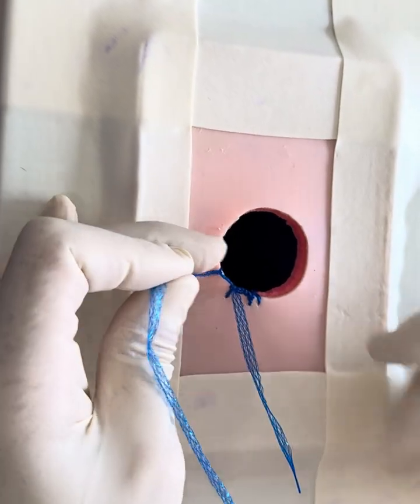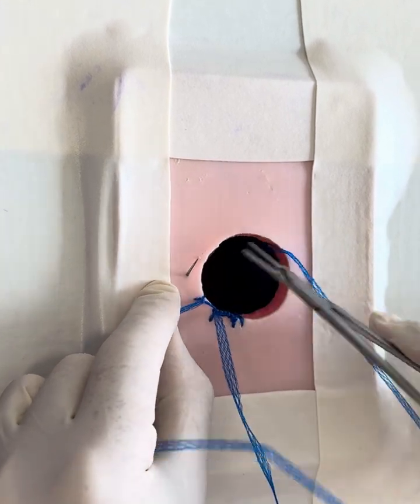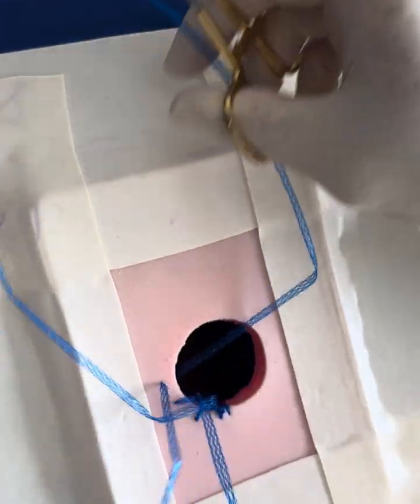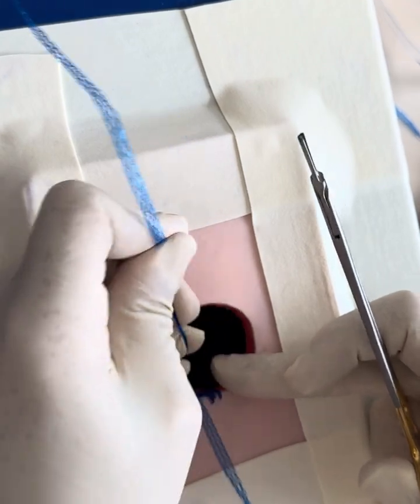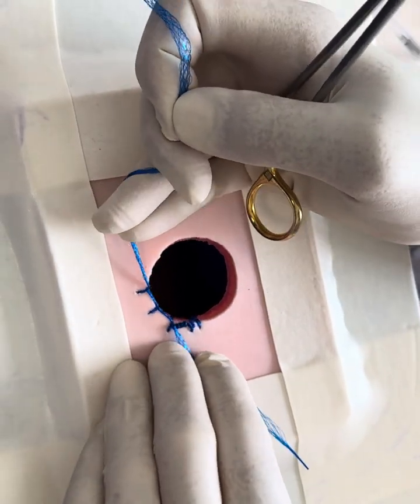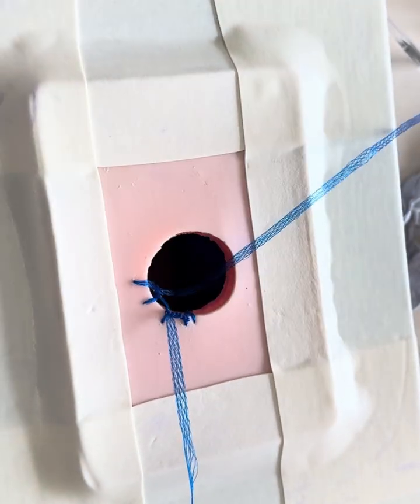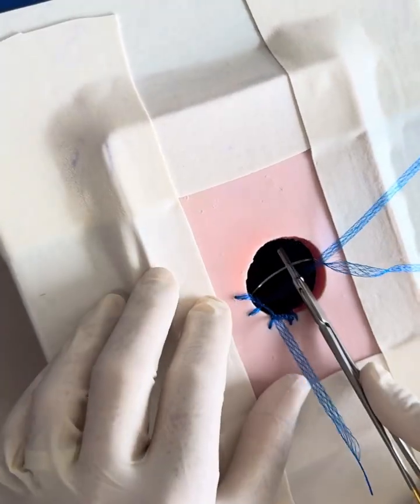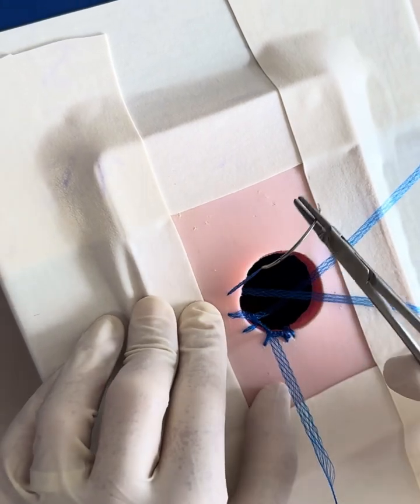And as you can see, it causes the Duramesh to lie nicely along the stomal opening, and each time through the loop, pull the Duramesh through. And if we're dealing with a big parastomal hernia where we've got a much bigger defect, each of these bites can be pulled a little bit tighter, and that shrinks the defect down. If we're just reinforcing a primary stoma, a new opening, then they can just sit snug rather than tightening the defect.